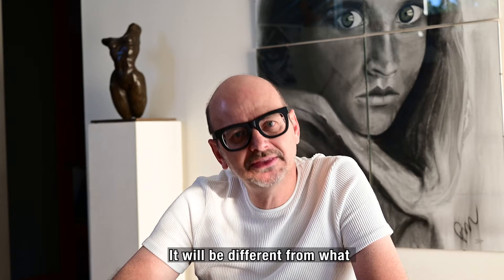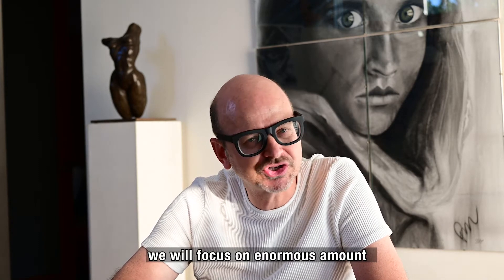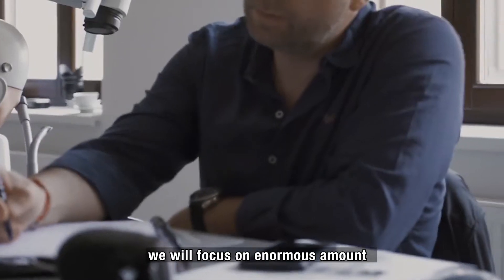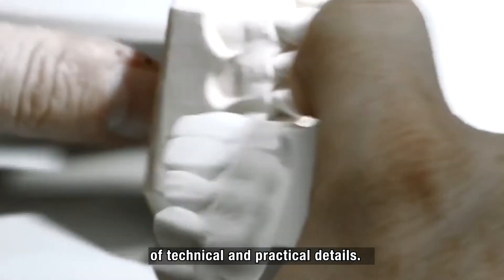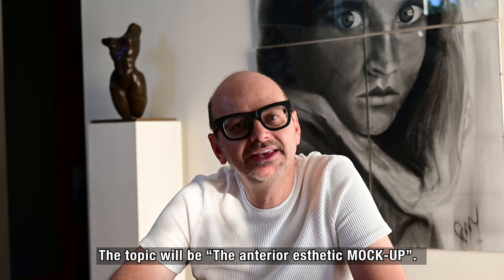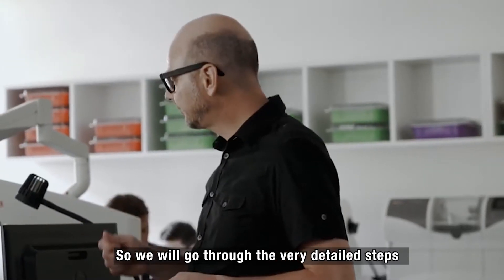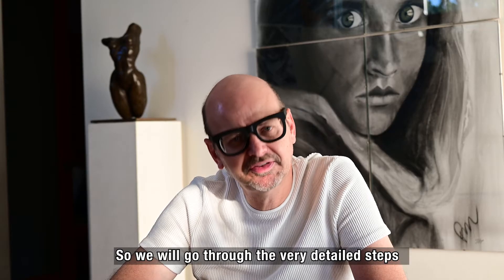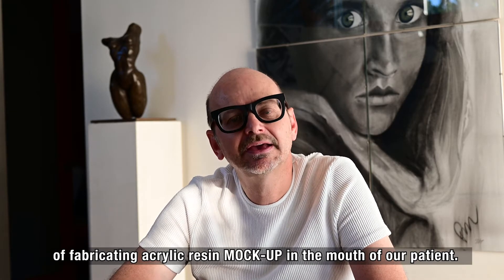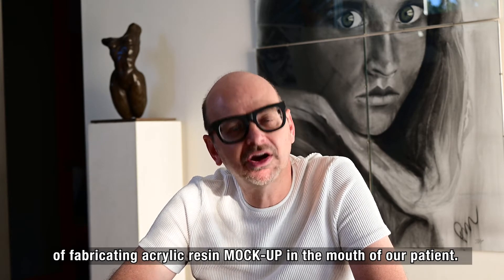This will be different from what I have done so far because we will focus on an enormous amount of technical, practical details. The topic will be the anterior aesthetic mock-up. We will go through the very detailed steps of fabricating an acrylic resin mock-up in the mouth of our patient.